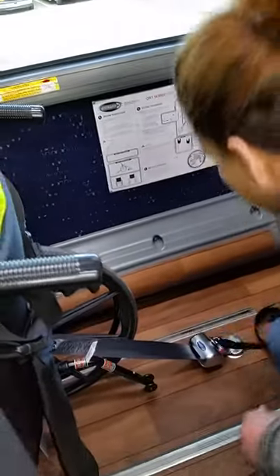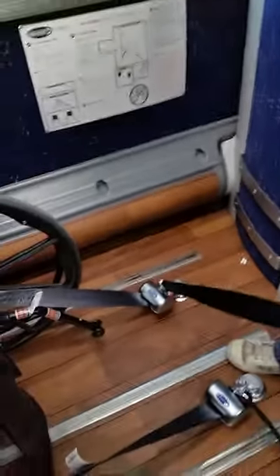Okay, go ahead and go backwards. Got it? Now hooking up the lap belt.